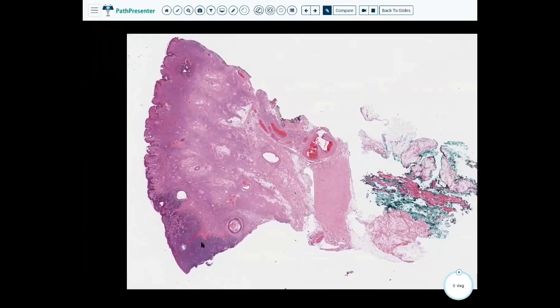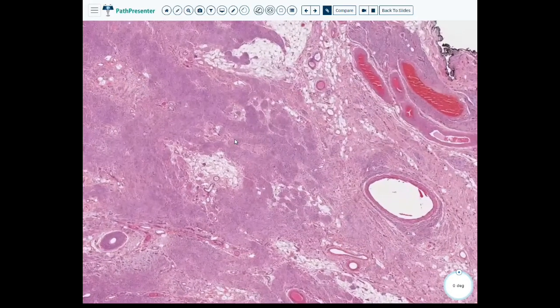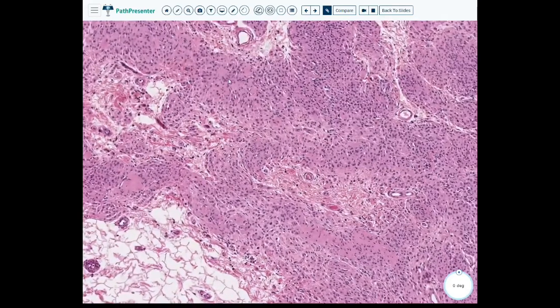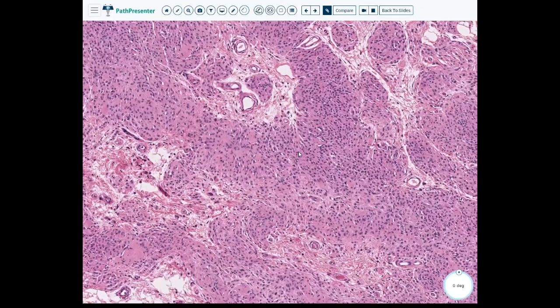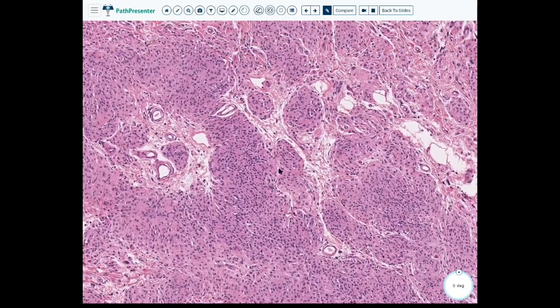At first glance, I admit myself that this is what drew my eye. So we are going to look at this, but this case, really I wanted you to focus on everything that was going on here. This stuff's just detached and normal. It's fibroadipose tissue, but if we go in, what we see is that this isn't the collagen fibers that we would expect in our reticular dermis.